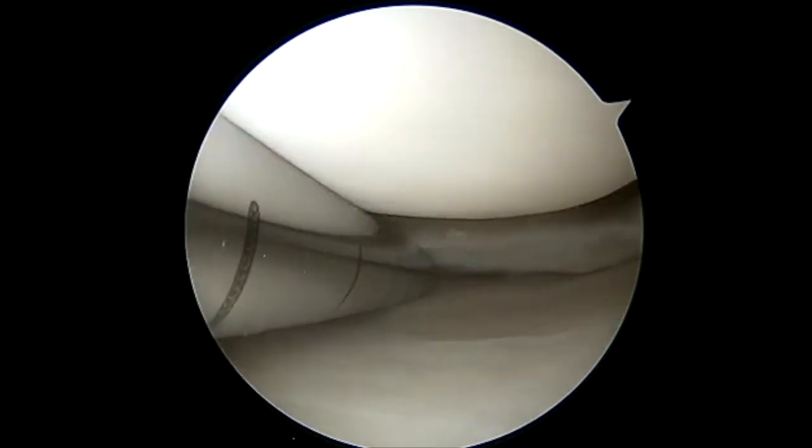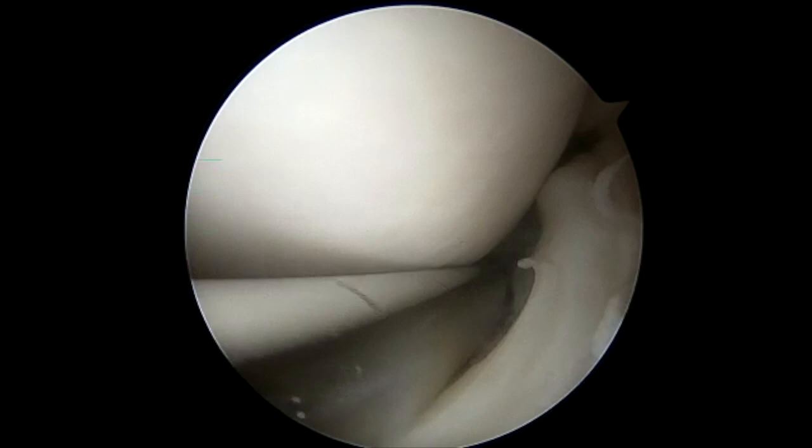We use a shaver to further roughen up the capsule to allow for an excellent bleeding edge once the tourniquet is released. We clean up any remaining small tears.